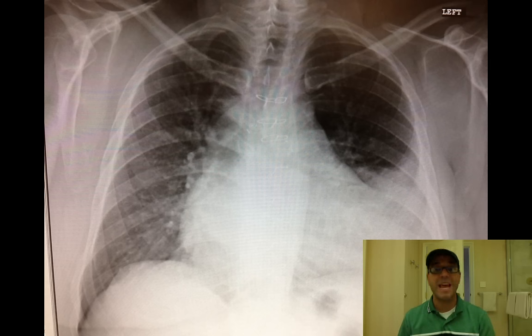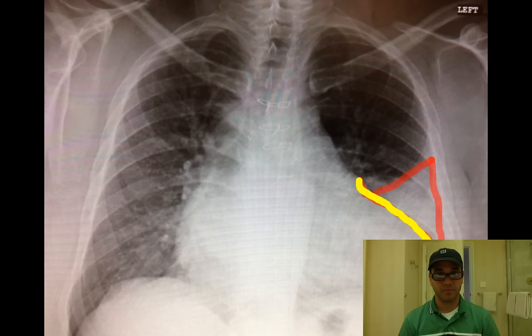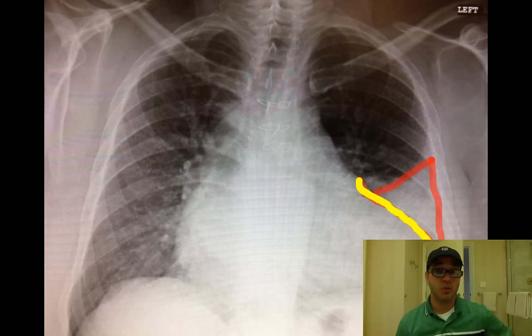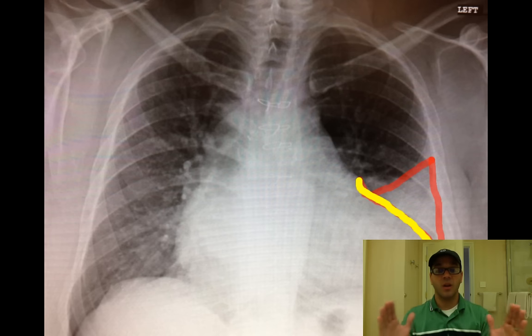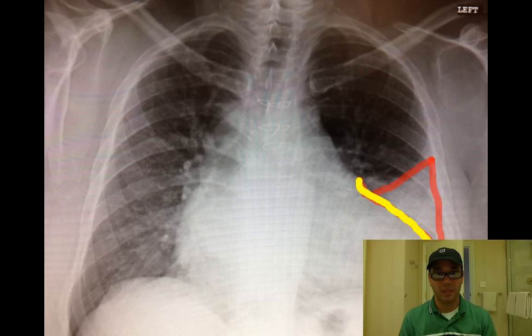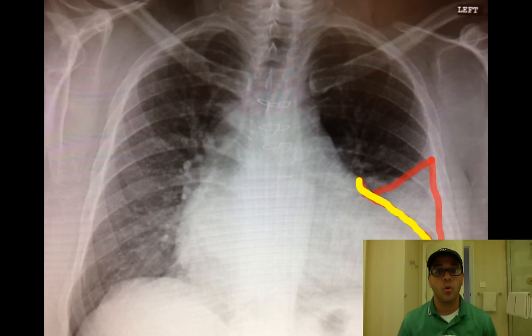The heart itself is enlarged — it's more than 50% of the cardiothoracic size. A cardiothoracic ratio of more than 50% is cardiomegaly, or an enlarged heart. The other thing you see here, if you follow that yellow line, is the border of the heart on the left side, the left ventricle.